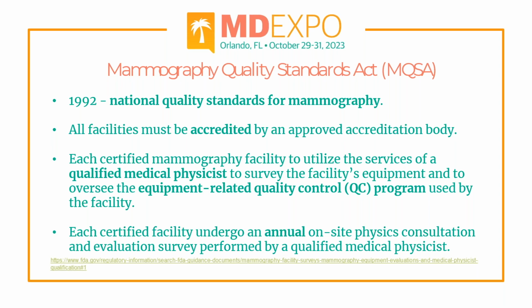So in 1992, the MQSA, or the Mammography Quality Standards Act, was passed, which basically set up national quality standards for mammography, and basically said that if your facility has a mammography machine, then you better be accredited by an approved accrediting body. You can't just install a mammography unit and perform mammography.